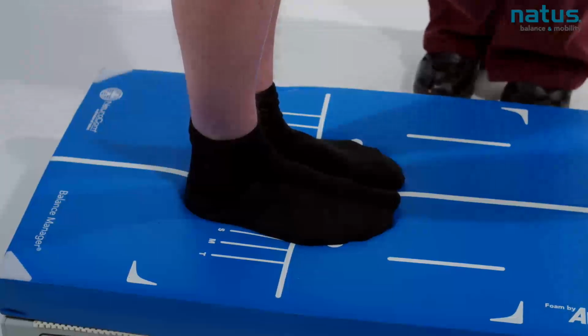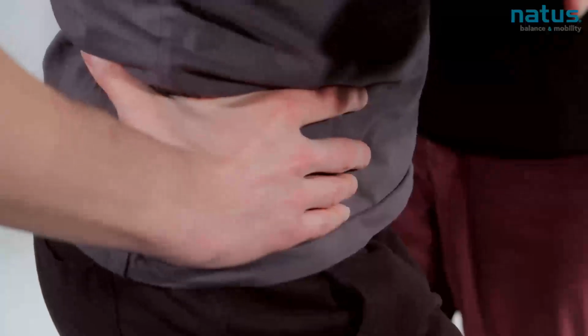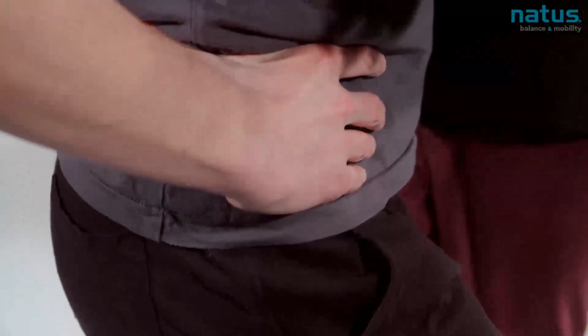Nicely done. Okay. We are now ready to move on to the single limb stance on the foam. This is condition 5. This is a very challenging condition. Many normal individuals will lose their balance on this condition. What I'm concerned about is your safety. If you feel like you are losing your balance, please open your eyes or put your foot down. Okay? You're going to balance on your left leg, hands on hips, as motionless as possible.